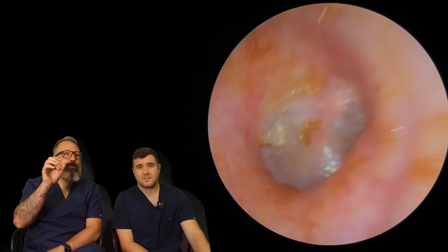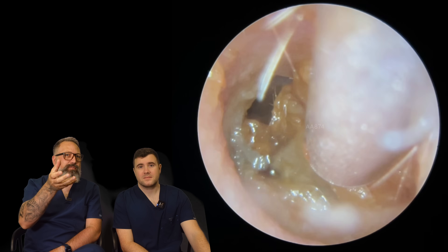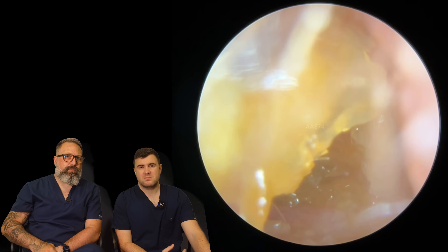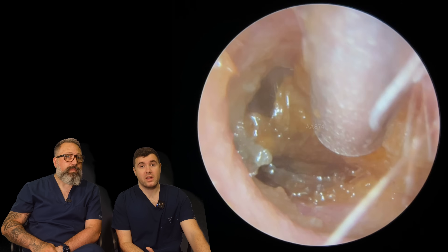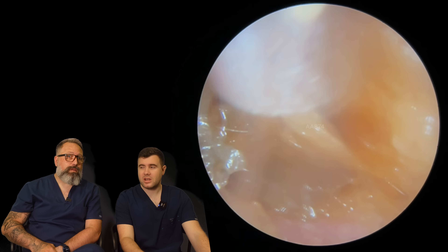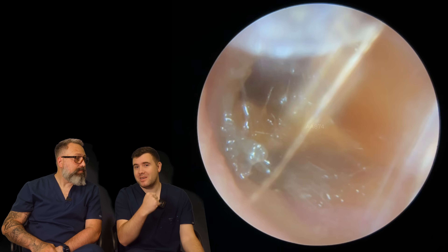The patient was almost on instant relief. When you start getting those bigger plugs away, sometimes the patient will still say, 'Oh, are you getting anything out?' Because if you've got those kind of pieces right down on top of the eardrum, it's still a bit of an issue. We do get a lot of patients that naturally will have a hearing loss they may or may not be aware of. There are some people we remove a big blockage like this and then they feel there's no change. So if that ever happens and you've never had your hearing tested, just get your hearing tested, because there may be a hearing loss there as well.